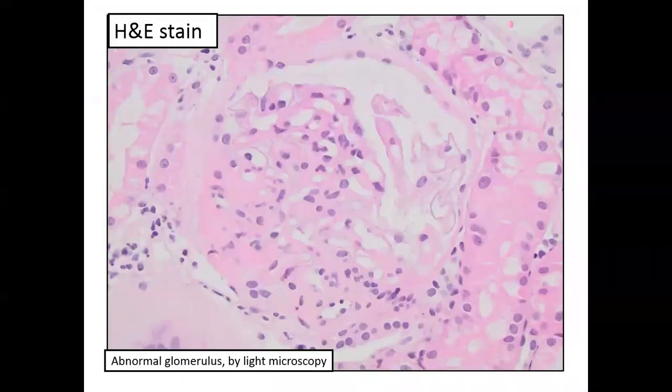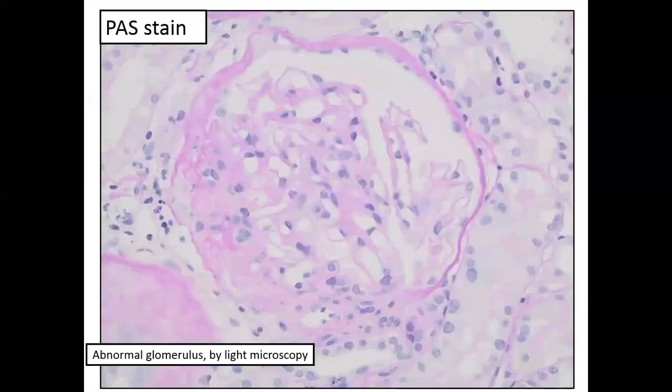Okay. Yep, great. So we have about 5 minutes to get through the last case. This is another one where we definitely have abnormalities on the glomerulus. We have an adhesion between the tuft and Bowman's capsule, and we have this extracellular matrix, so we have segmental sclerosis and a synechia. So we have an abnormal glomerulus. The PAS, again, shows the same features I just described, a little bit of mesangial hypercellularity, but if I'm looking at the glomerular basement membrane, it looks pretty good.